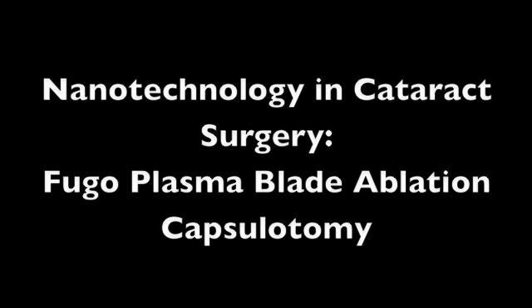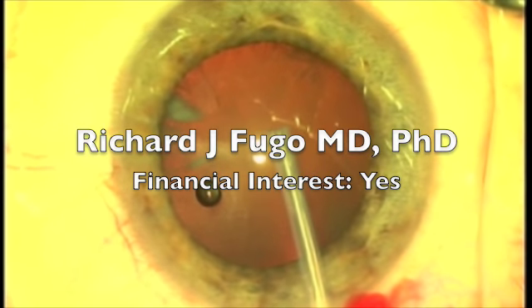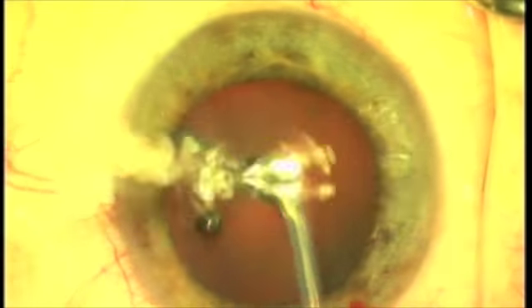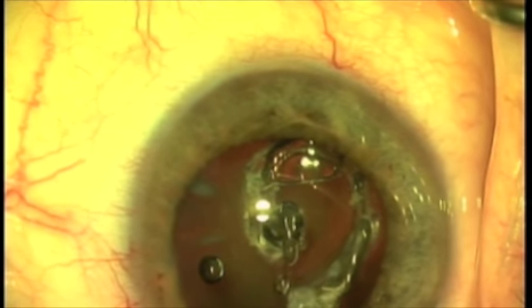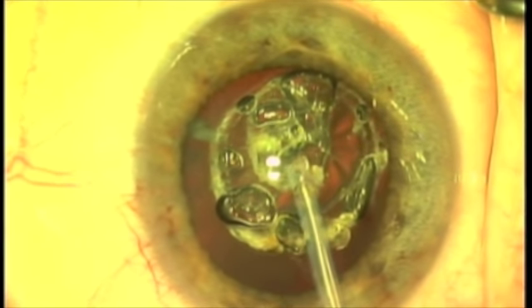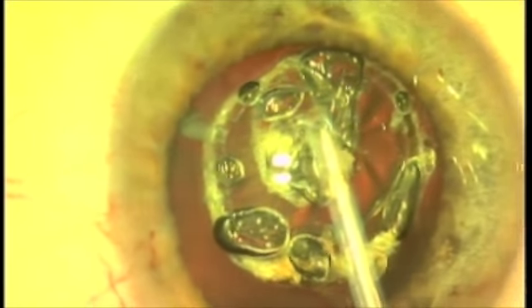Today we're going to show you how to enter the nanotechnology era of cataract surgery. We're going to use the Fugo Plasma Blade to plasma ablate or fragment the molecular lattice of the anterior capsule, as we're showing you right here. We take a minute amount of plasma energy along the tip of the Fugo Blade, and it is absorbed by the molecular lattice just as a laser beam is absorbed by matter.